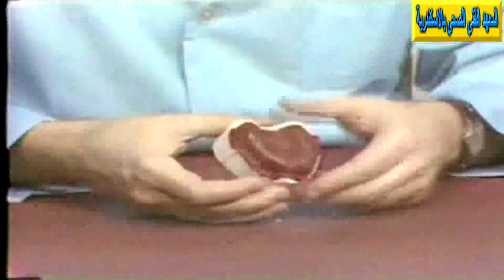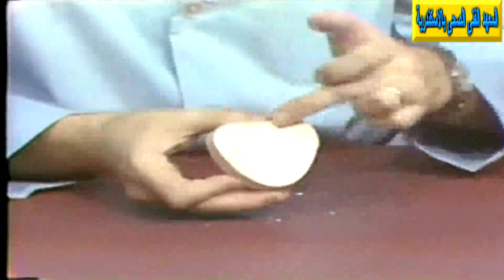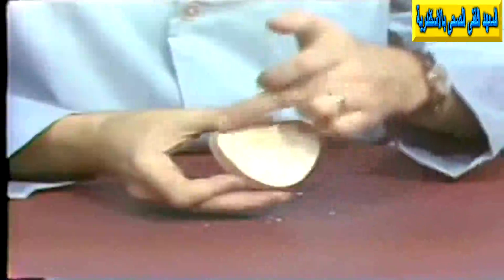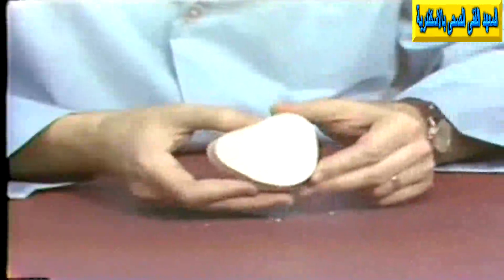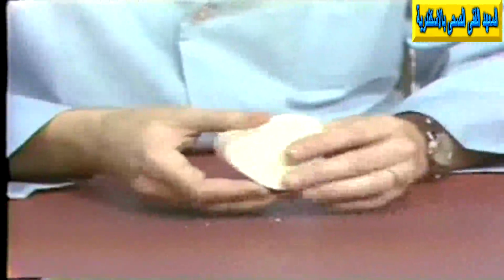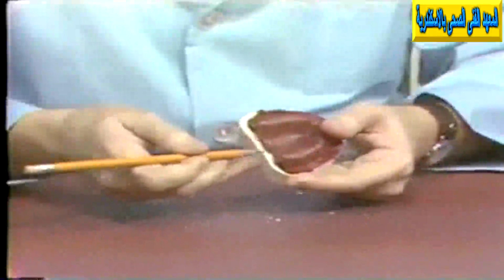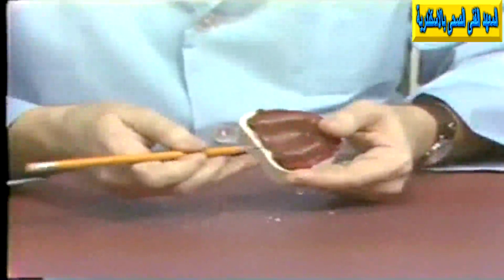Now the last step is to remove the impression from the cast, and then we go to the model trimmer and do any final trimming. It will be minimal because we have done this with our wax, but we'll do any final trimming at the peripheries to establish the even boxing edge. The boxing edge, once again, comes from the boxing strip that we used, the boxing rope that we used initially.